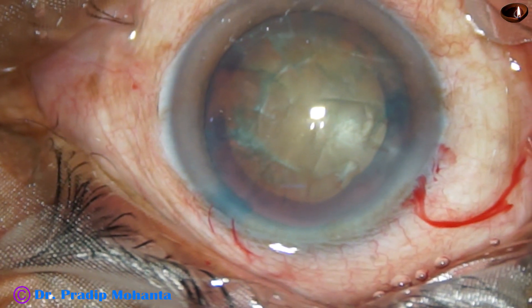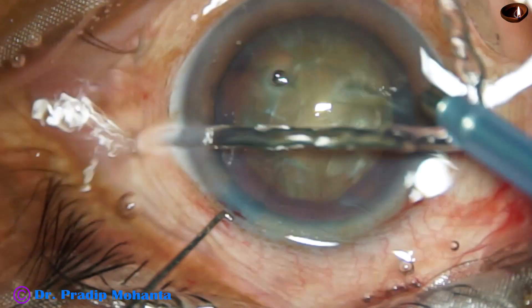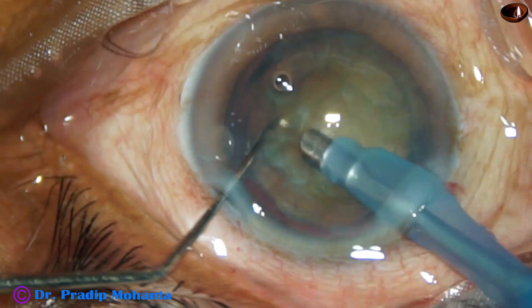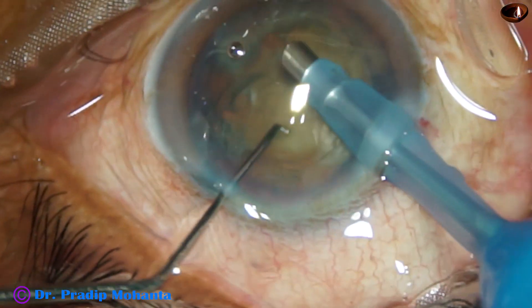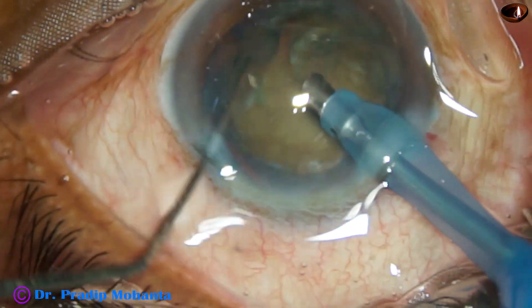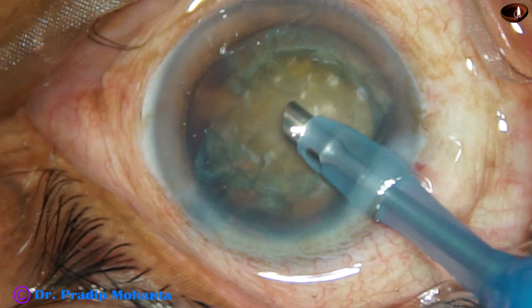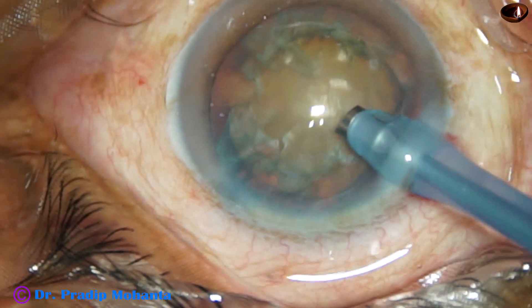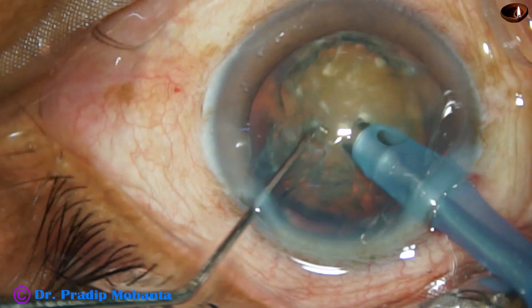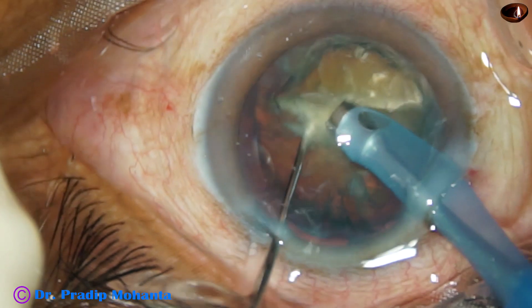The phaco needle goes into the anterior chamber with bevel down. Some superficial cortical lens matter is removed, and now the nucleus is rotated nicely. The phaco needle is then turned to make its bevel up, buried into the substance of the nucleus, going through towards the opposite equator, and it is chopped.